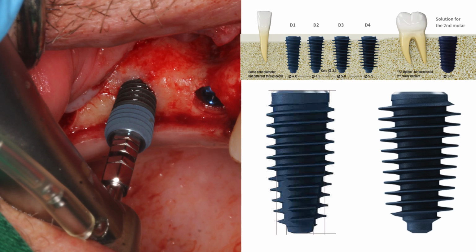As you can see here, there are different configurations for dense bone versus not. So it has a lot of nice features that will give you the primary stability we're looking for, especially in a case like this, where our desire is to do a one-stage surgical protocol.